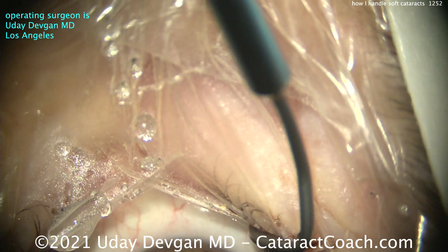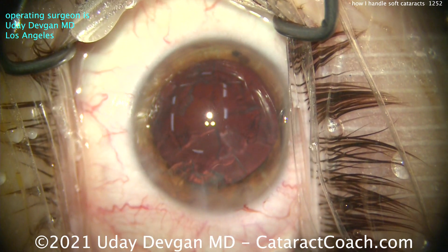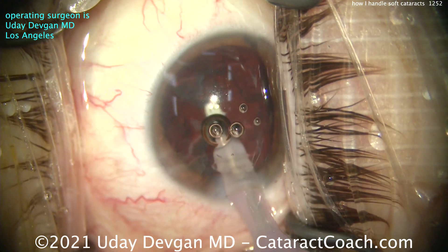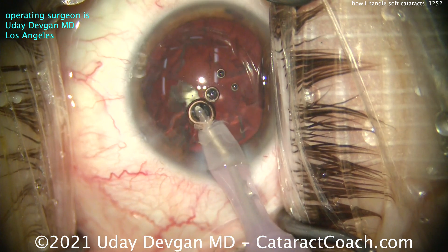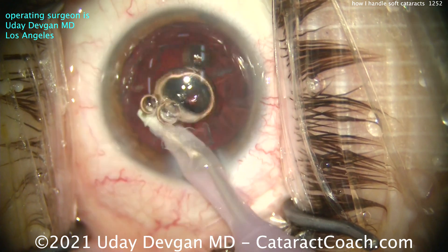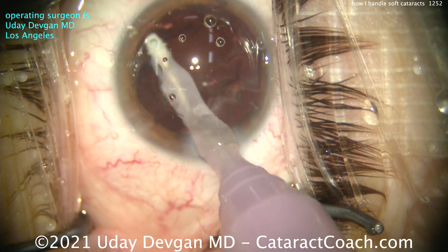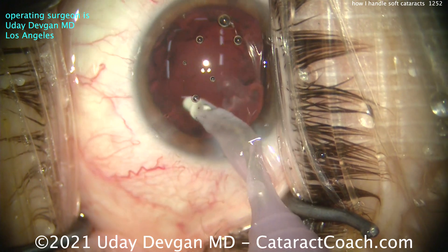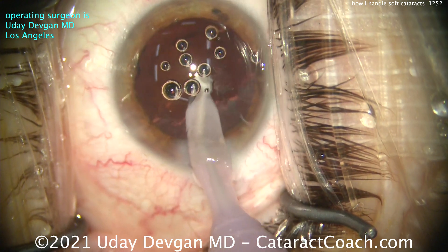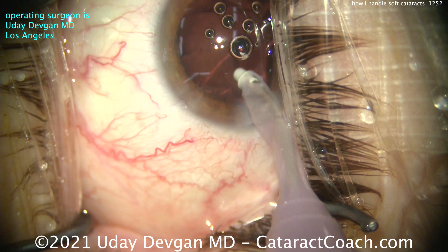Now it's time to do the cortex removal. The key for young patients with a soft cataract: I want that lens out of the capsular bag. I think the risks are higher in a young person — the patient has so many more years or decades left of life and you really have to have a near-perfect or perfect outcome. That means you really have to be careful about working too much in the capsular bag. I don't want to damage the capsular bag.